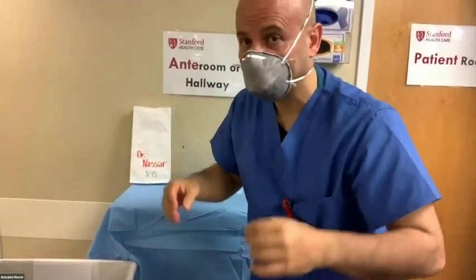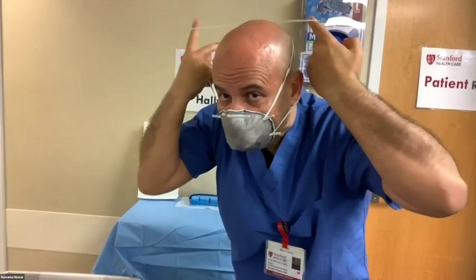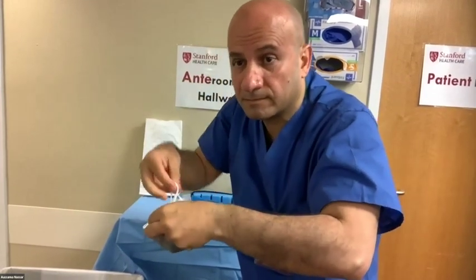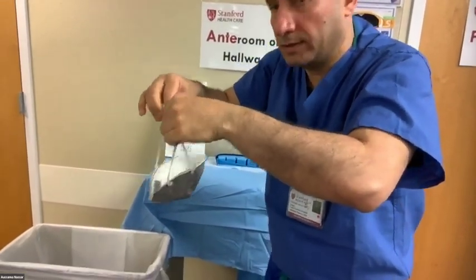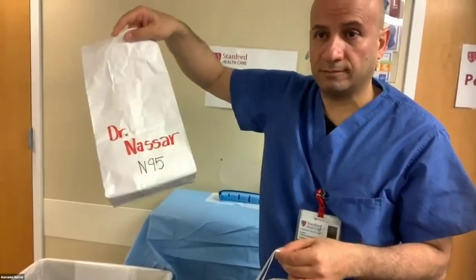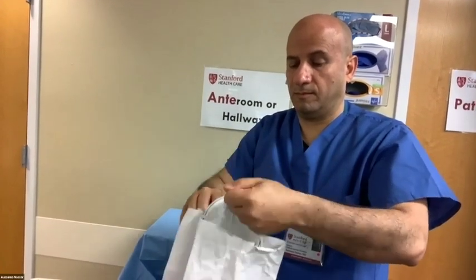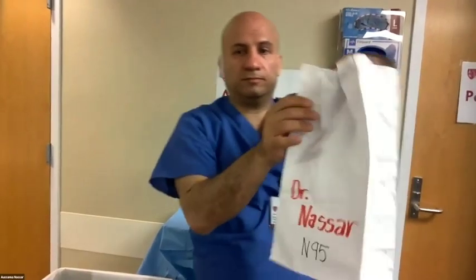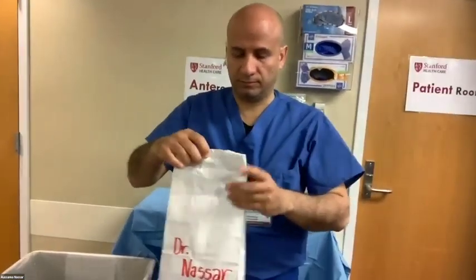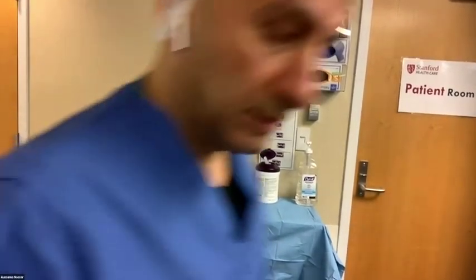The next step is to doff your mask. Remove the mask without touching the exterior part or your face. Remove the bottom strap and then the top strap, pulling them forward from the back of your head. If you're reusing the mask, use a breathable paper bag. Write your name on it to prevent accidental reuse. Drop the mask inside with the outside of the mask facing downwards.